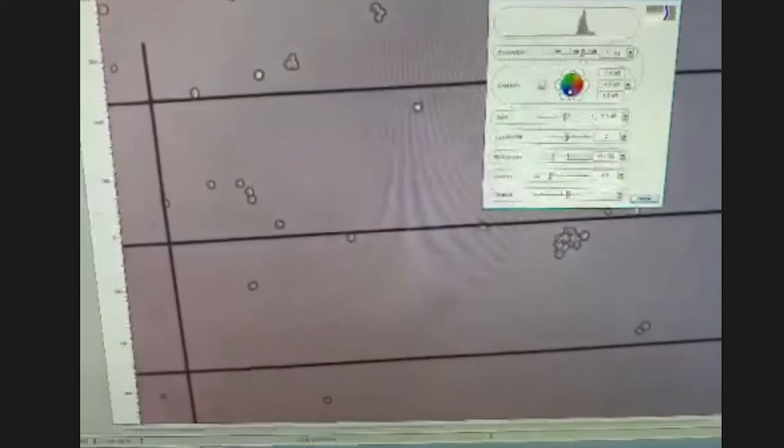Just be careful: HepaRG cells can form clumps or clusters. You can see these clusters here. It is important to count all the cells forming a cluster. Attention à ces agrégats de cellules — on doit tout compter. Par exemple, au niveau de cet agrégat, pour être précis, il faut compter toutes les cellules. Lucie, est-ce que c'est possible de montrer avec ton doigt pour pouvoir compter les cellules?